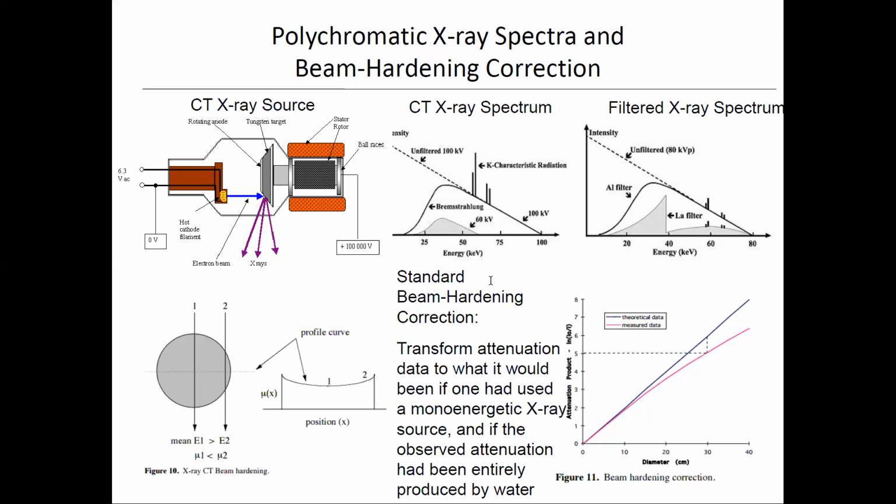This is approximations, right? So what you approximate patients as is made out of water of different densities. So in other words, your calculational model would be what the world would be like as a cartoon world, where that's what exists. You can have different densities, but everything has the same relative abundance of Compton scatters, which is electrons, to your photo capturers, but all the same material. If that was the case, then your beam hardening you would get from it, you could have a one-to-one map, and you see it for water, right? You calibrate it for water, you see everything else has the same beam hardening.